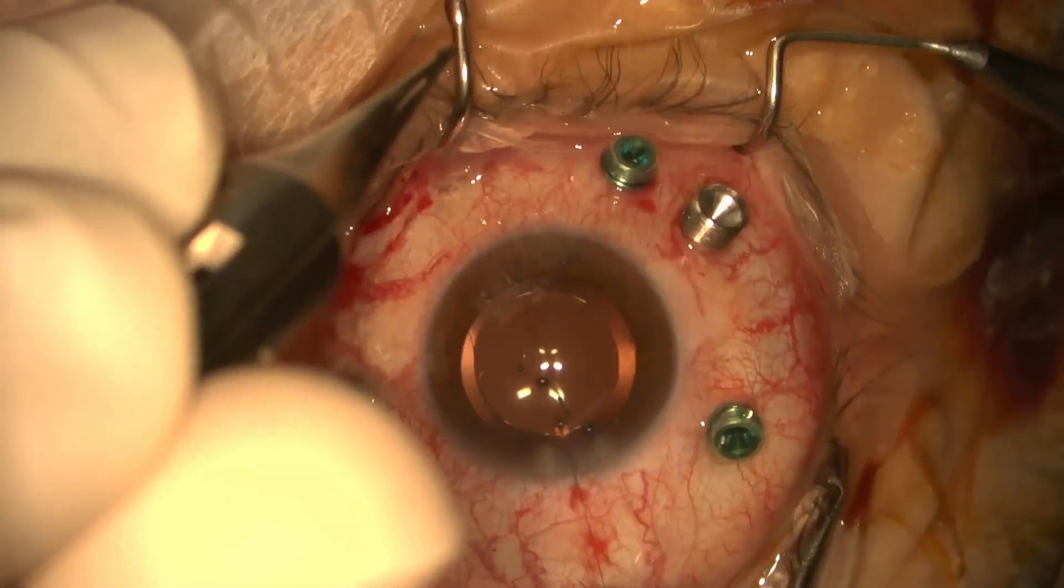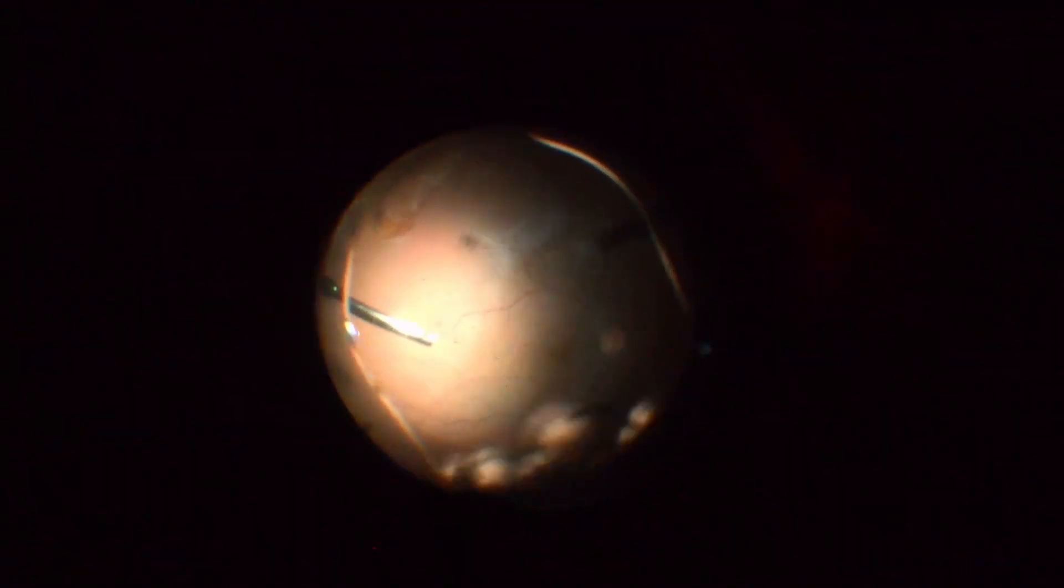The surgery begins with a routine facoemulsification with IOL implantation in the bag. We proceed then with a core and peripheral vitrectomy.